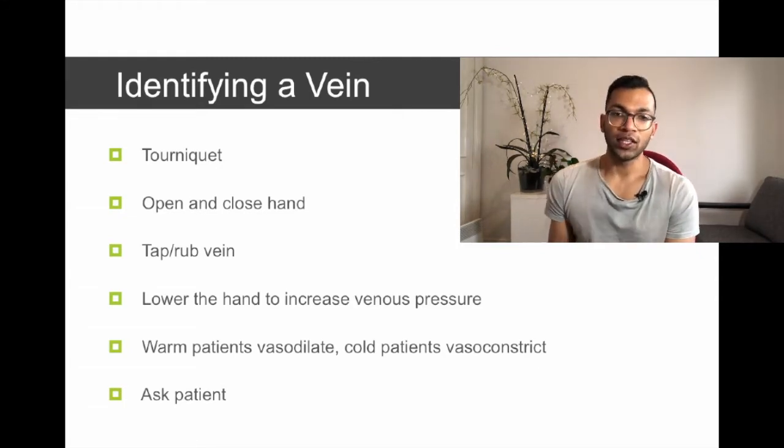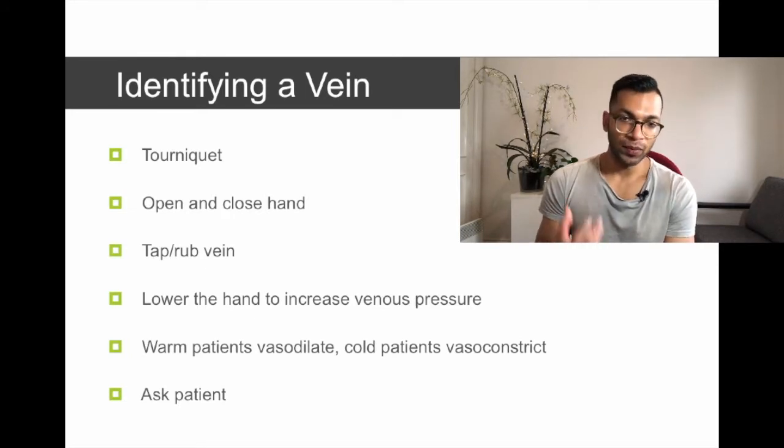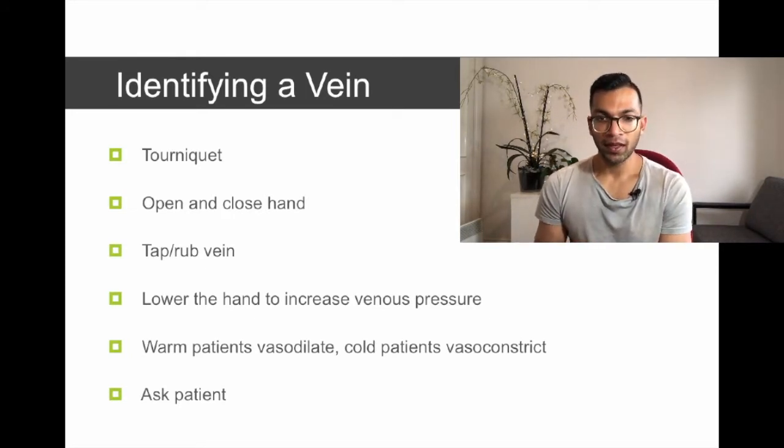Usually, most people would get the patient to open and close their hand. Muscular movement will promote venous flow back proximally as well, but also can help warm up the hand and just get blood moving and increase the metabolic activity of the hand to have more blood supply going to those muscles.